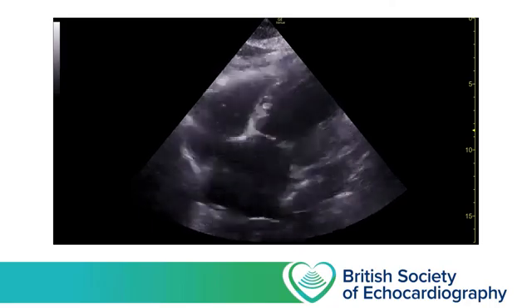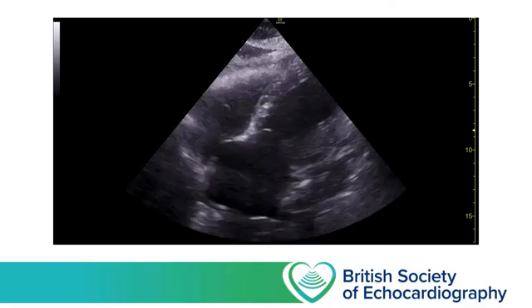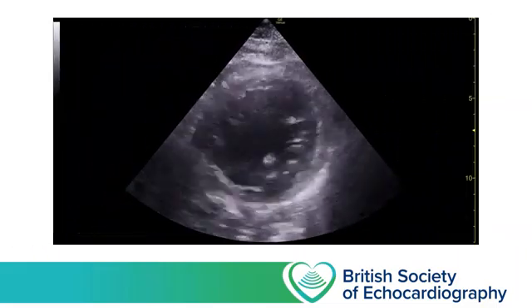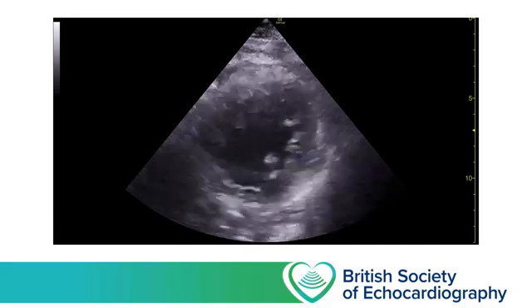In addition, the LA is dilated and there's fixed bowing of the intraatrial septum from left to right, telling us that we've got a high left atrial pressure. Now, as we don't have any parasternal windows, this is a subcostal short axis, and this is an oblique cut, so walls aren't necessarily directly opposite each other.